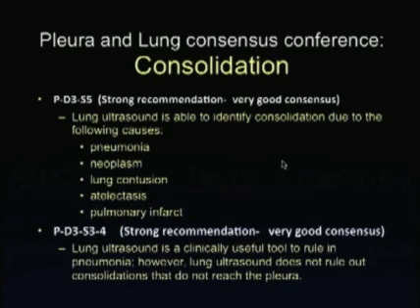I think most experts consider that about 90% of consolidations reach the visceral pleura adjacent to the parietal pleura that can be imaged. Obviously, some consolidations will be adjacent to the diaphragm or the mediastinum, neither of which is sonographically identifiable from transthoracic ultrasound.